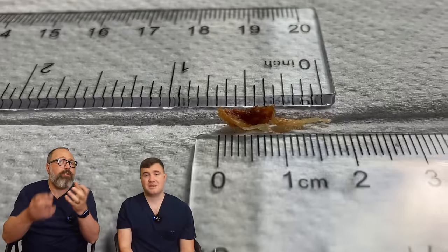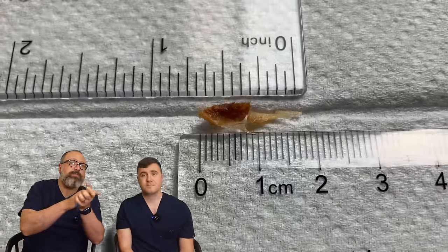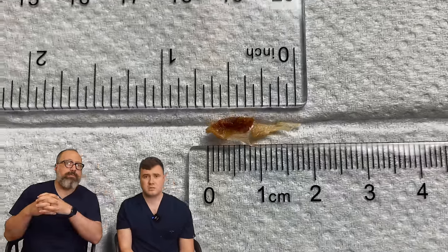That was a difficult one. Obviously most of the skin got sucked inside the tube, but this is about two centimetres of skin — yeah, three quarters of an inch.